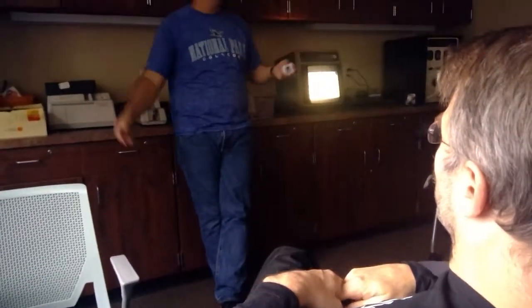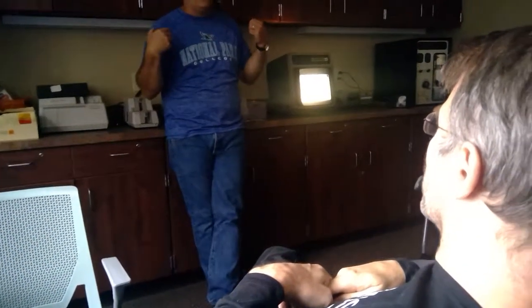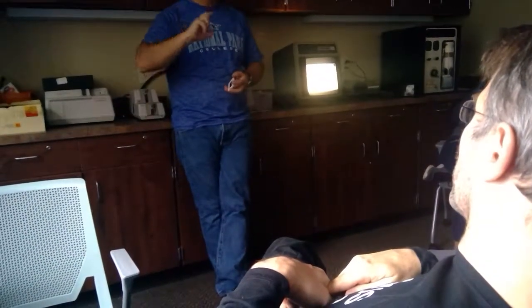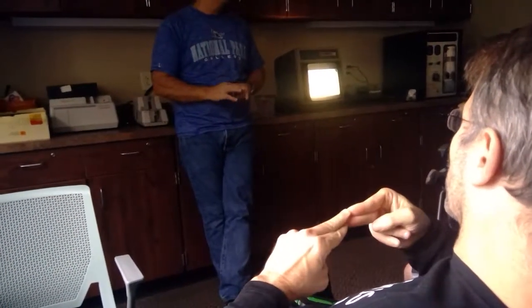Dilute it. Now, one thing that you'll see a lot of techs do is they'll put one drop of the straight sediment like you normally do, and then maybe put a drop of saline, okay, and then get a little stick and mix it up. Even though you're diluting it, there may be something in there that's significant that you can't see because there's so much blood in it, like a cholesterol crystal or tyrosine crystals. There just may be something in it that you need to know. Maybe there's trichomonas in it, but you'll never see it because it's so thick. That's the only occasion that I ever remember actually diluting sediment out, so you could see through it. Sometimes with amorphous you have to do that. Even though you let it come to room temperature and you're trying to make all that amorphous go away, sometimes it obscures everything that's in there, so you have to dilute it.